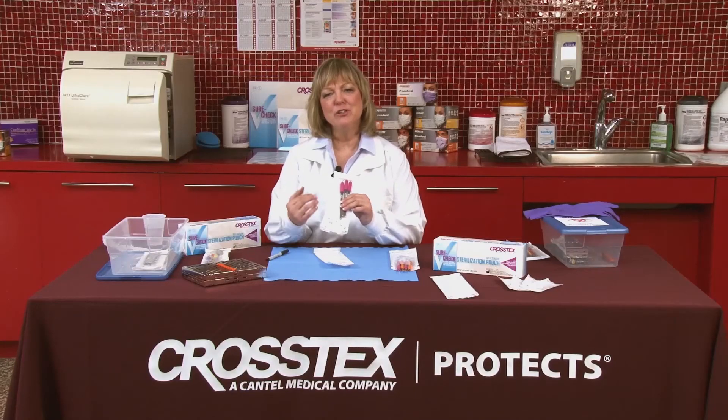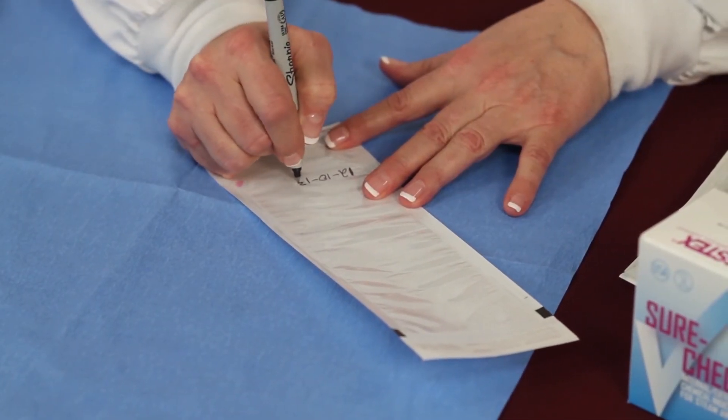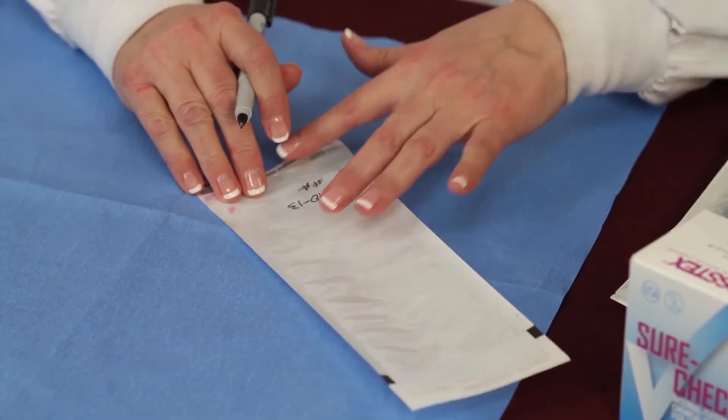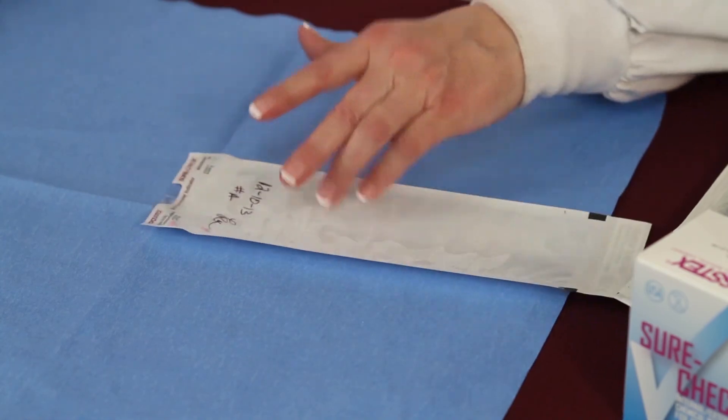So what information do we need to write on our instrument pouches? The information that you want to write is the date. We also need to identify the sterilizer that that pouch was placed into. And then the operator's initials need to be legibly written onto the pouch. Thank you so much.